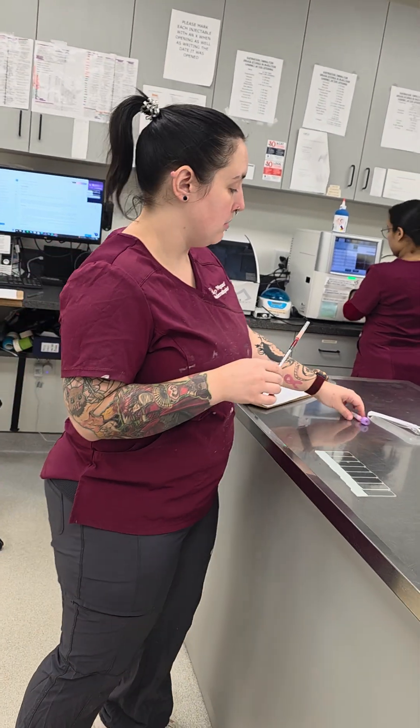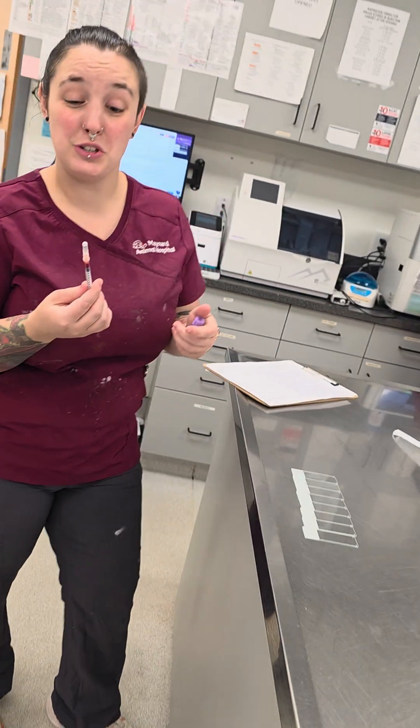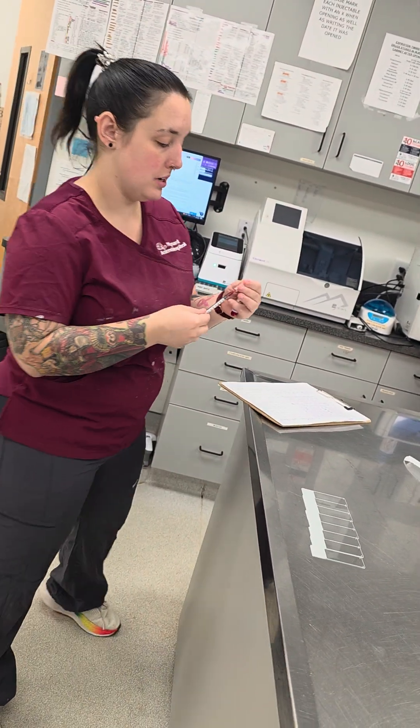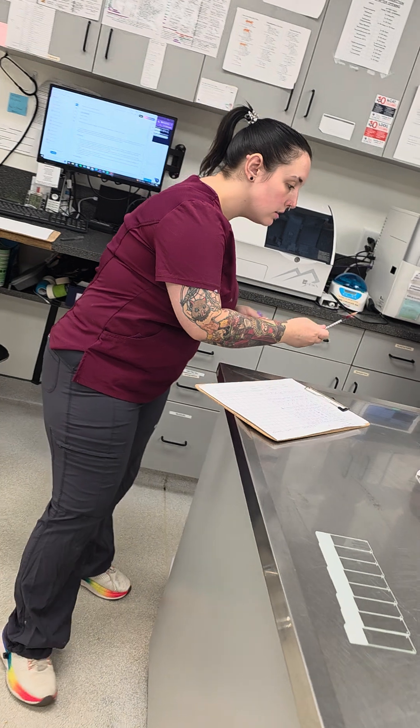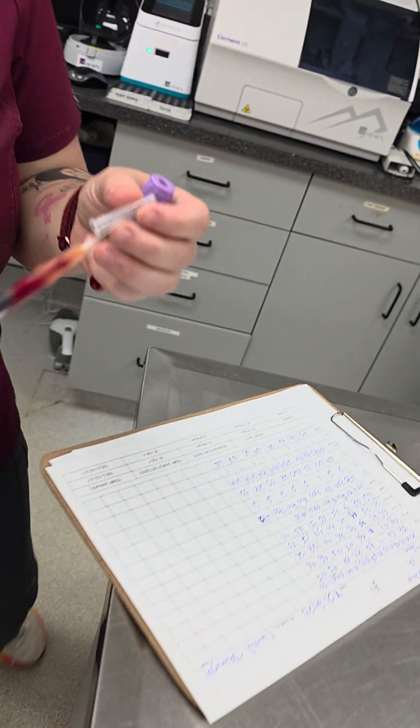Alright, we're going to make a platelet smear. So you have your sample, you get it in — it's easier for me to do it in a syringe — and then you will get on just to the edge, so that way there's no bubble.